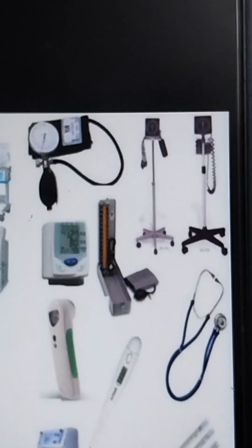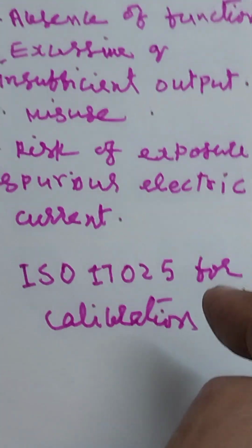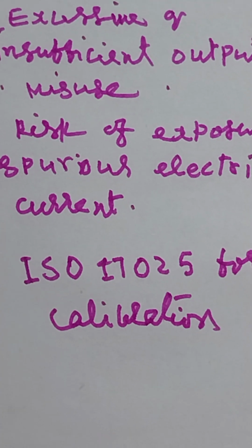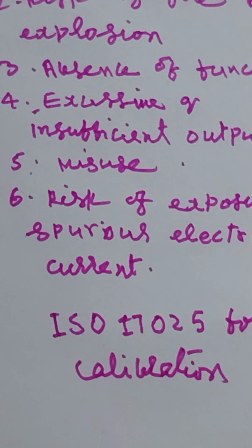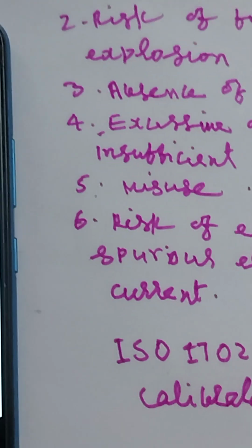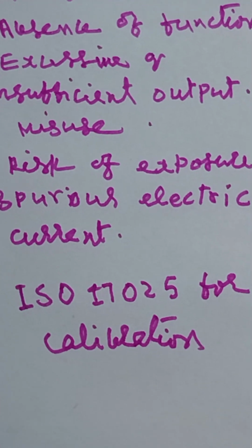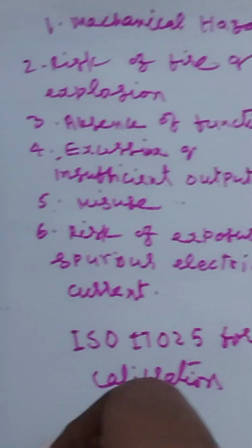And a calibration certificate is a document that only an ISO 17025 accredited calibration center can issue. A calibration report is a document reporting the results of measurements issued on the instrument. Since no accreditation or recognition is required, it can be issued by anybody. For this reason, it comes in different graphic fonts and with metrological contents that are often incomplete, with missing uncertainties and missing information.